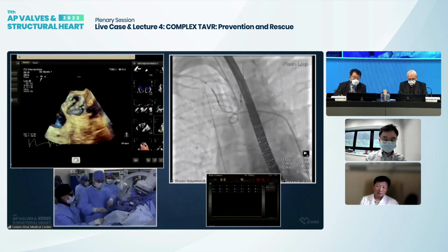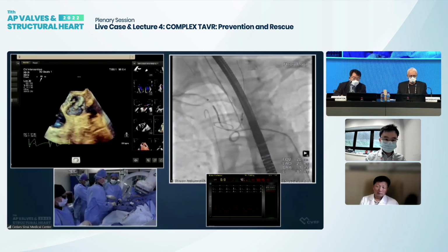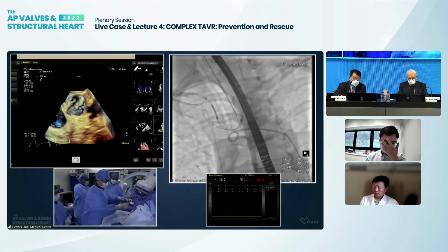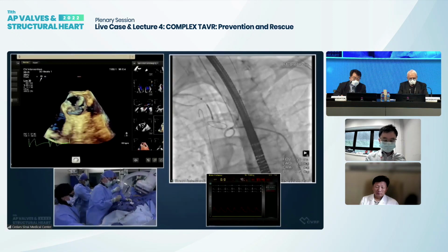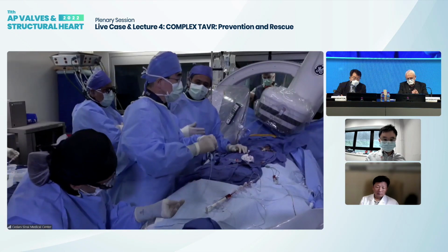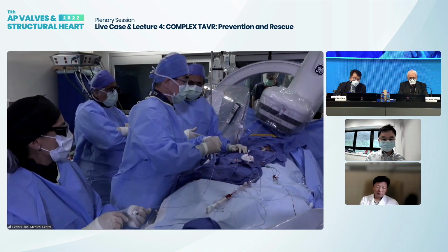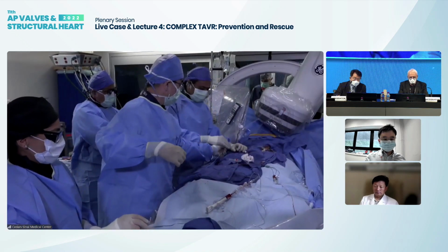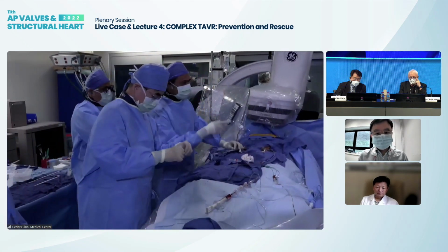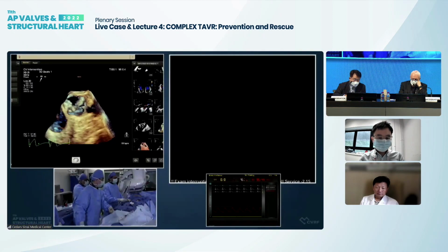And I think with these heavily calcified valves, we are waiting for the randomized clinical trial data from the PROTECTED TAVR study, which will be presented at TCT, right? The 3,000 patient study. Yep. But I think when you have these heavily calcified valves, Eberhard, both you and I are very, very biased towards the use of embolic protection devices. We'll find out what the data actually shows. Yes. But to us, it makes sense to use it, especially if the anatomy is favorable and not hostile, which is what the case was here.